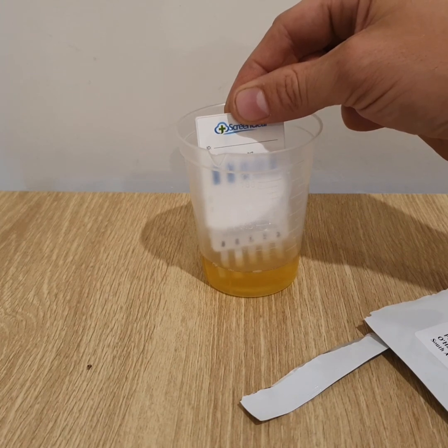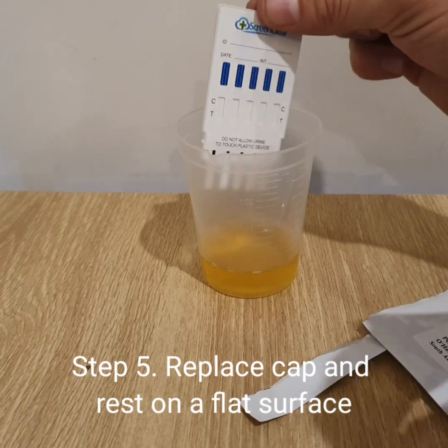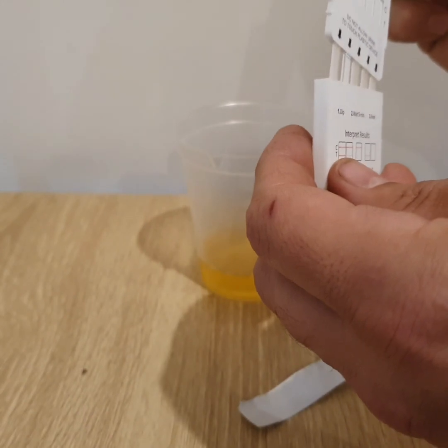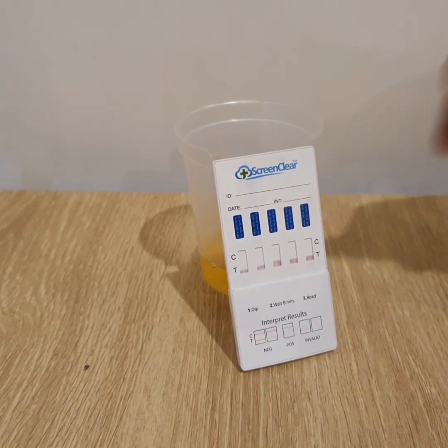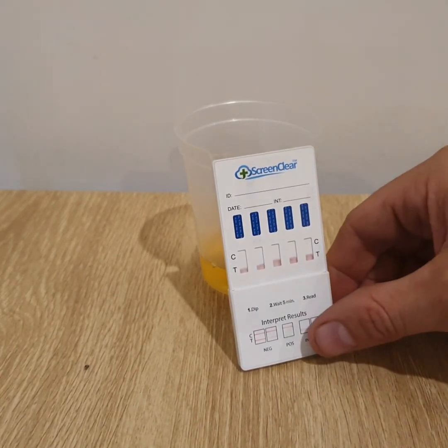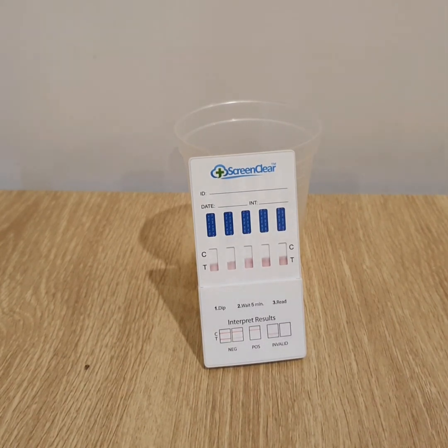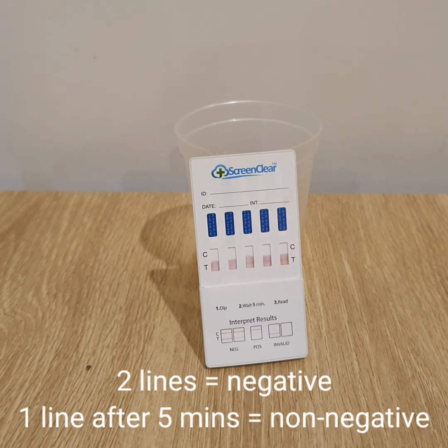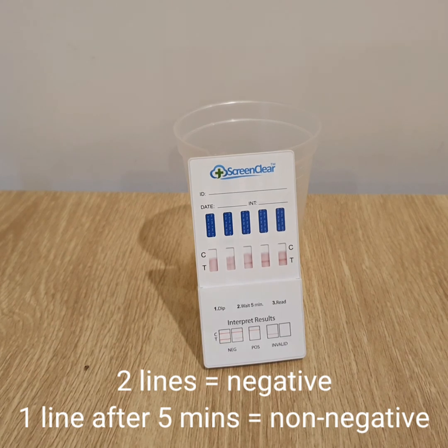First things first, you'll open up the device. Make sure the device is within its expiration date. Open up the foil, take the lid off, and as you've just seen, dip the absorbent strips into the urine sample and wait about 10 to 15 seconds for the strips to actuate. Then replace the cap and read the results after five minutes. This test won't always take five minutes — as soon as you see two lines appear in any drug strip, that is a negative result, just like all drug tests.